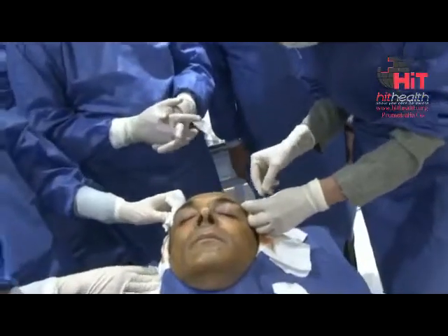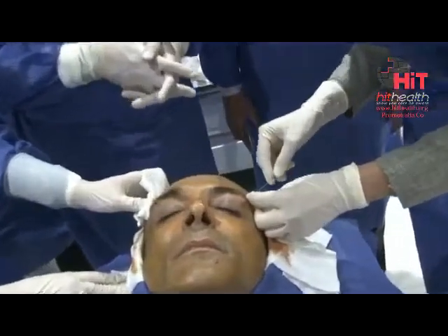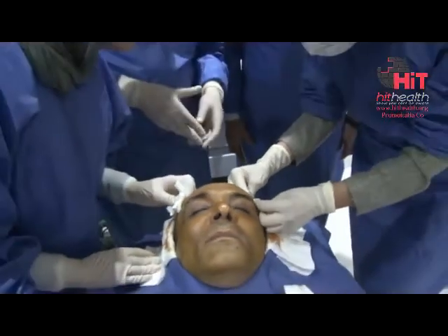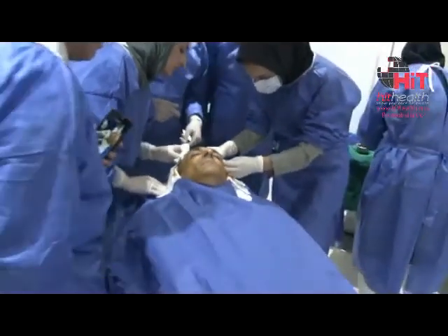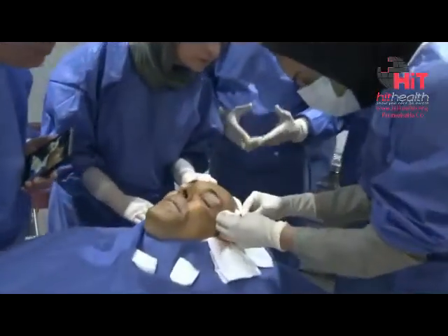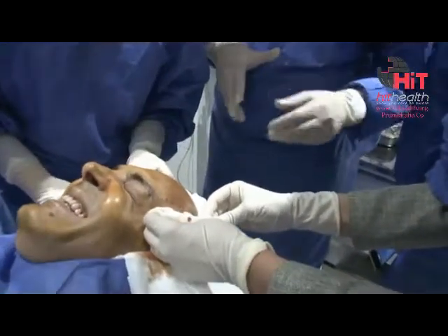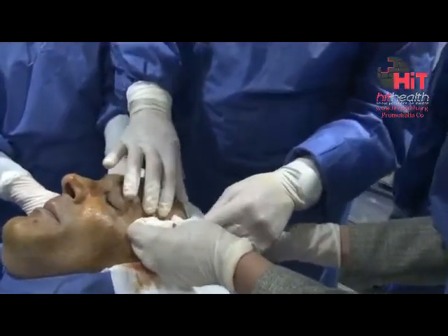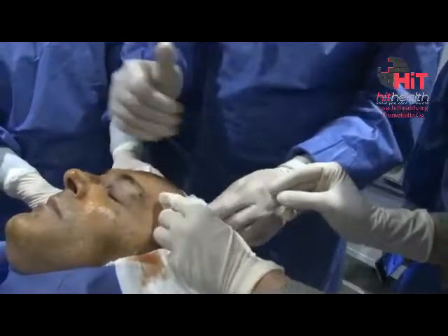Perpendicular. Feel the bone, feel the bone. And the bone — go up. Perfect. Dottoressa, you are a teacher. Maybe a little bit superficial. Scoop. Okay, scoop.